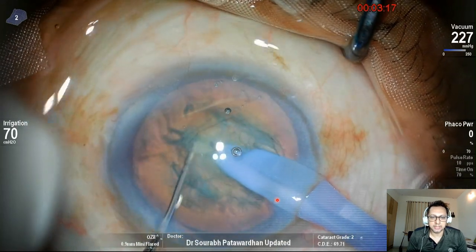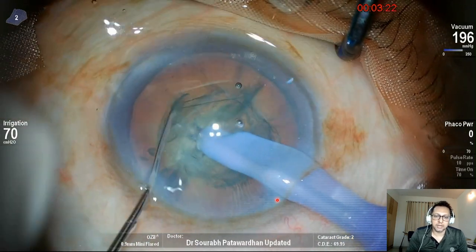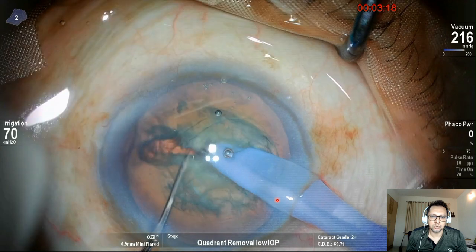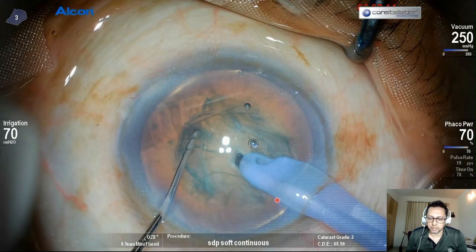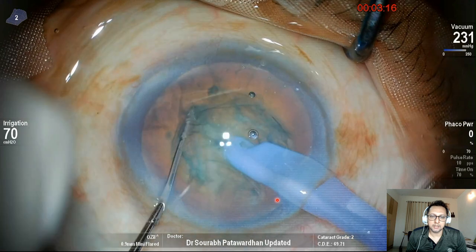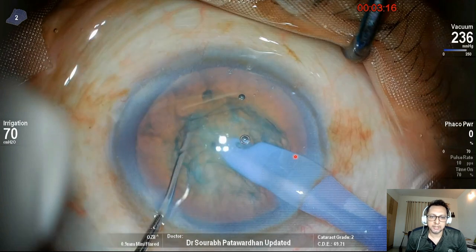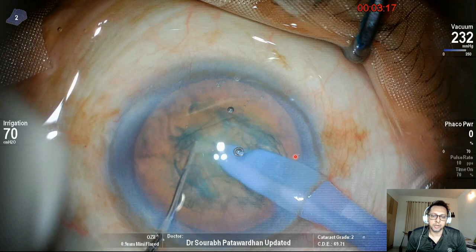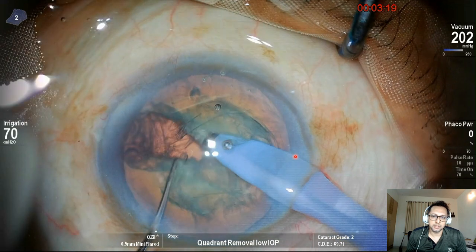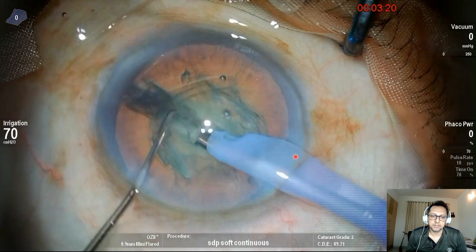There it goes — you can see the tip buried nicely deep inside. Then my left hand comes in. The tip starts going down inside the nucleus and I'm holding the vacuum at 230–250. The FACO power is now zero because I've already buried my tip. Then I introduce my left hand, which is a 1 mm Sinski hook. It goes towards the FACO tip first, and then it starts doing that lateral movement to separate the nucleus and chop it into two halves. So that's how it's done.